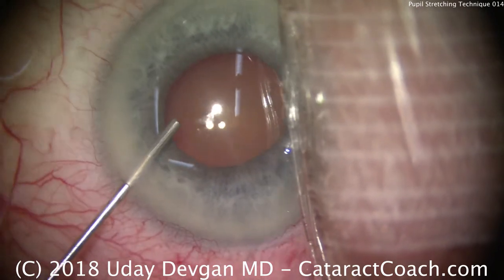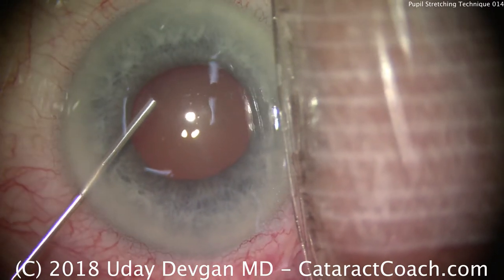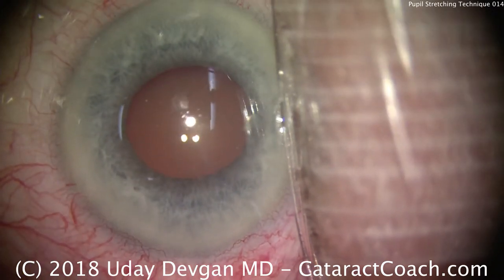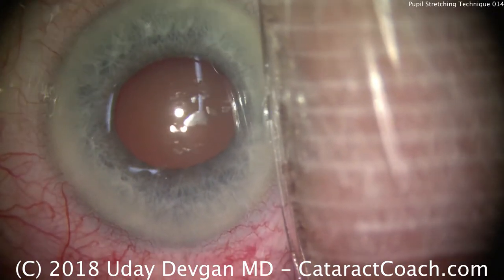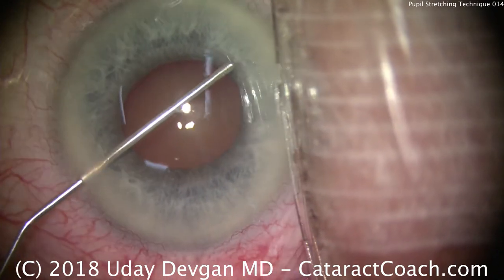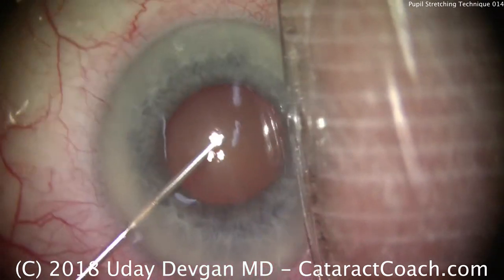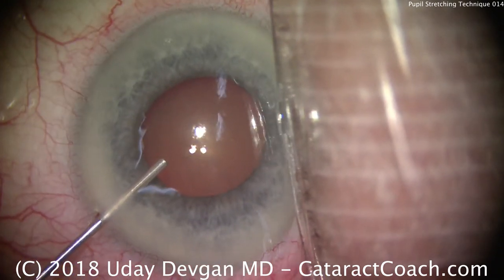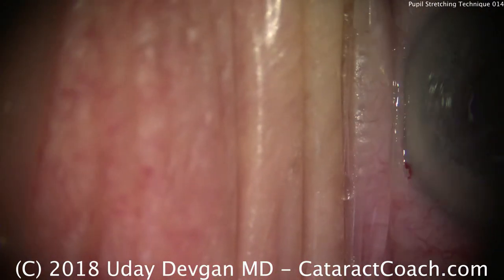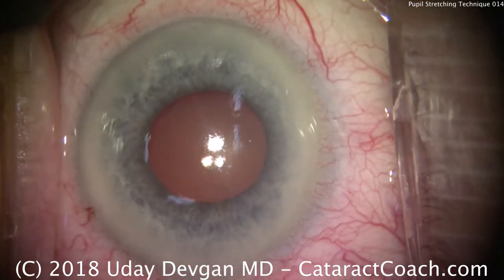The first step is to put some anesthetic as well as phenylephrine, preservative-free, in the anterior chamber and also under the iris. Give that a little bit of time to work, and that can help dilate the pupil more or at least give a little bit of increased tone to the muscle. Now, viscoelastic is being instilled, and you can see we're doing a viscomydriasis, trying to expand the pupil. We don't do a hard fill of viscoelastic, just enough to keep the anterior chamber pressure normal.